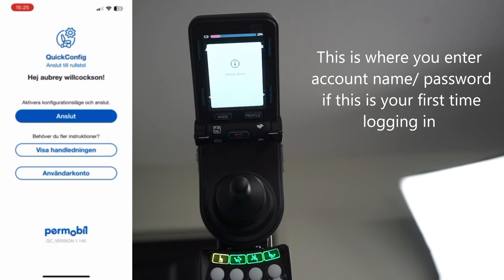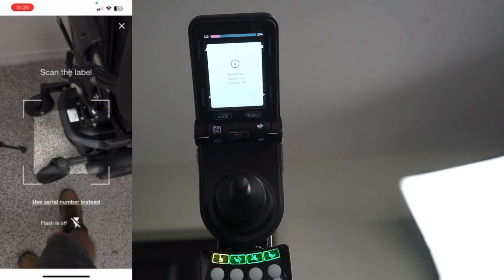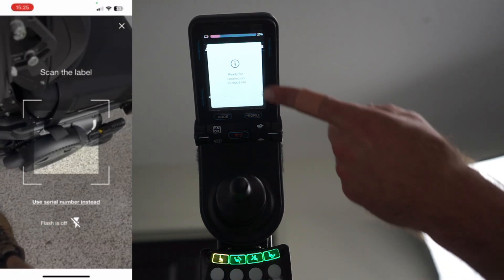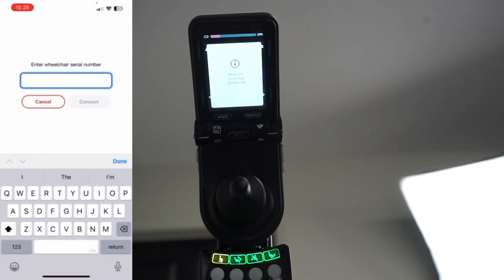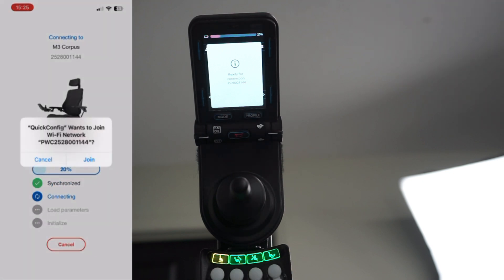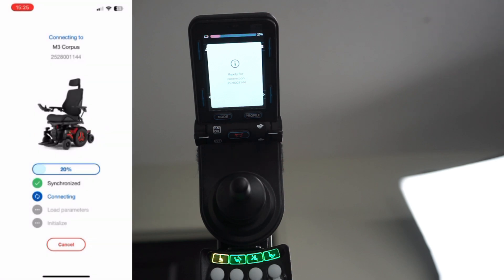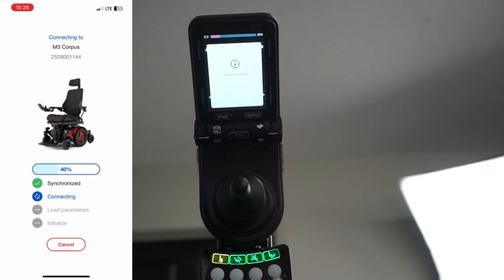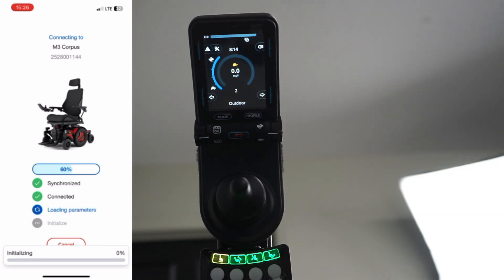Here is the opening screen. For whatever reason, sometimes it's in Swedish for me. I'm going to hit the blue button that should say 'log in.' Then it's going to say 'scan the label or use serial number.' This is where you scan the QR code at the base of your chair, or I prefer to use the serial number. As you can see, it says 'ready for connection' and gives you the serial number right there — that's a lot easier. Go ahead and enter that and hit connect. It's going to give you a prompt to join — I'll hit join. This is on iPhone; I'm not sure how this would appear on Android. As you can see on the screen, it says 'linked to device.' Now we're just going to wait on it to connect — it's finishing connecting and loading the rest of your settings.